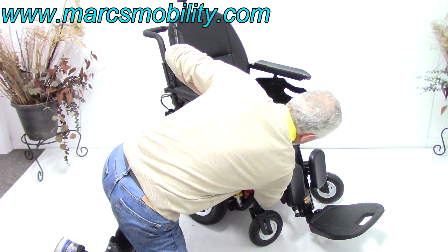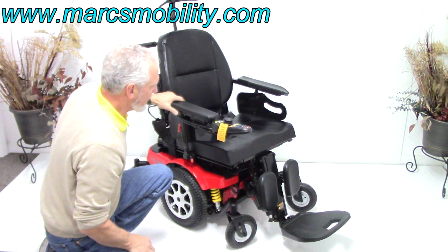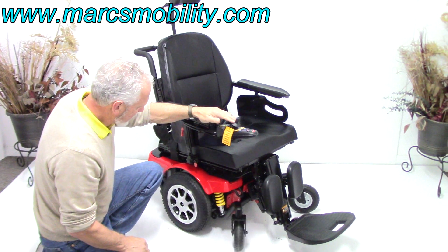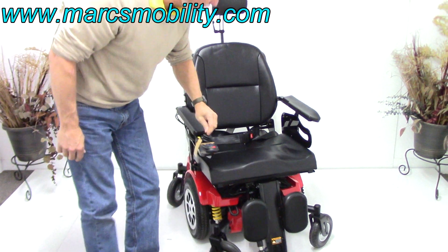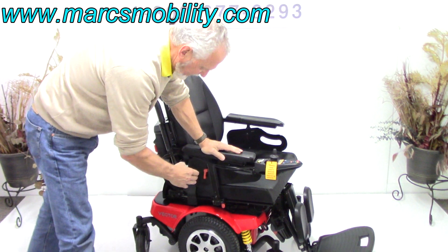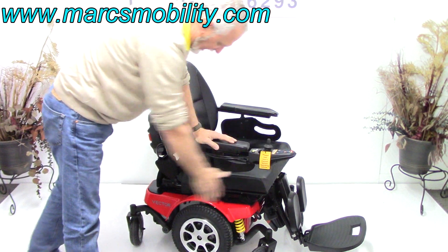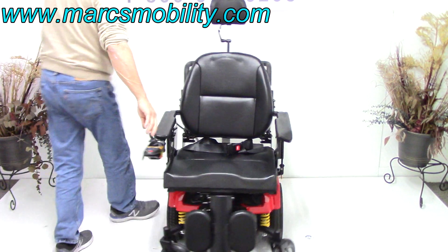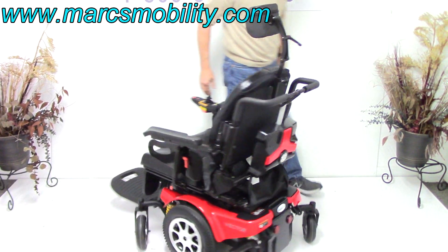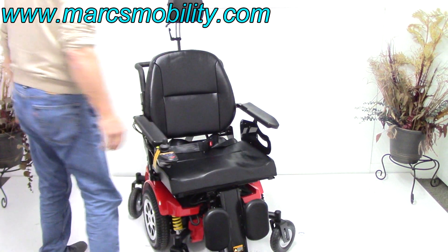Push them back down, turn the power back on, and you're back in drive mode. This is a mid-wheel drive chair, so this chair will turn on its own length — if I put a box in front of that foot plate and a box behind, I can turn in a circle all day long.